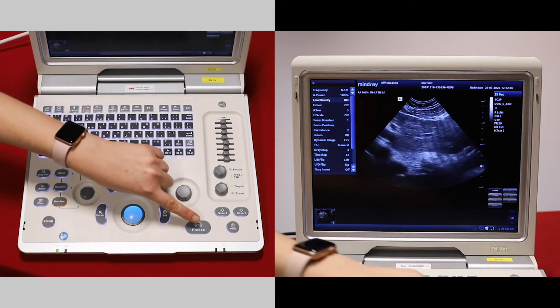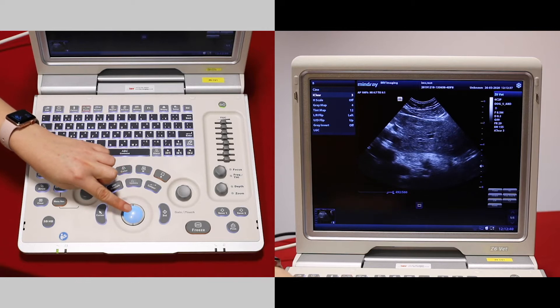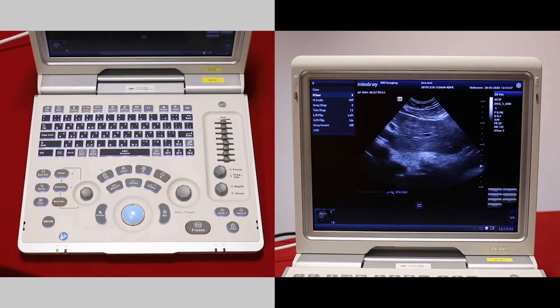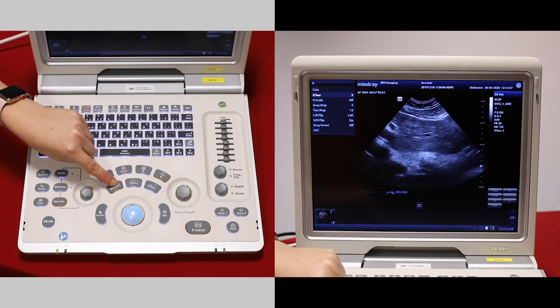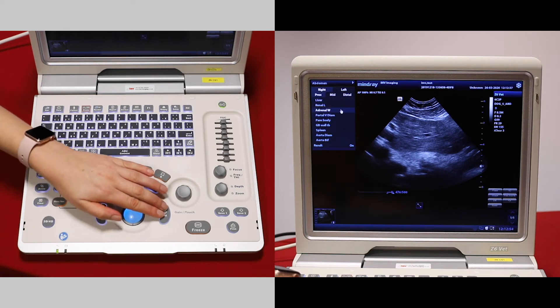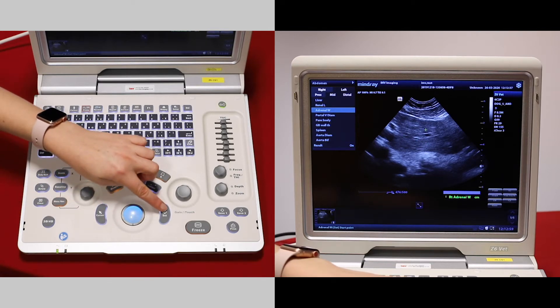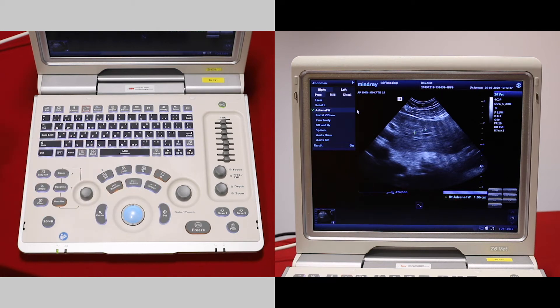If you want to take a measurement, press freeze. You can then scroll back to where you want to take your measurement. If you haven't quite got the right spot, use measure or caliper. Measure gives you a list of things you can measure — select one, make your measurement by moving the trackball, and press set to place the first caliper, and set again to place the second.